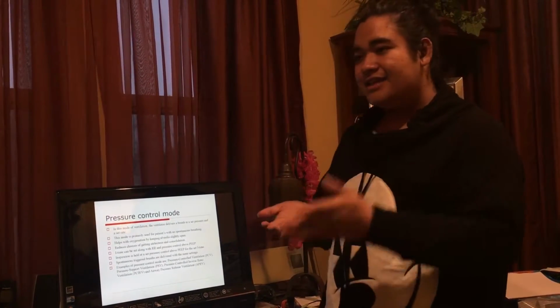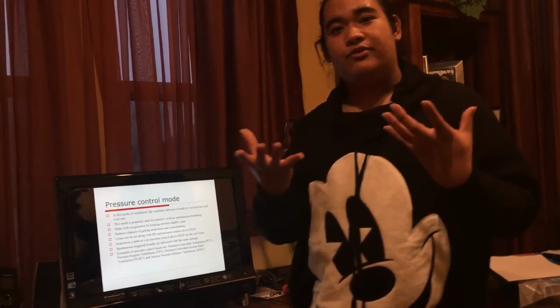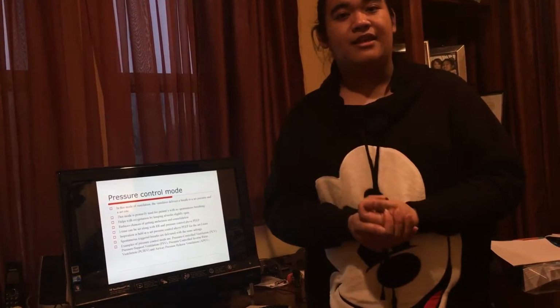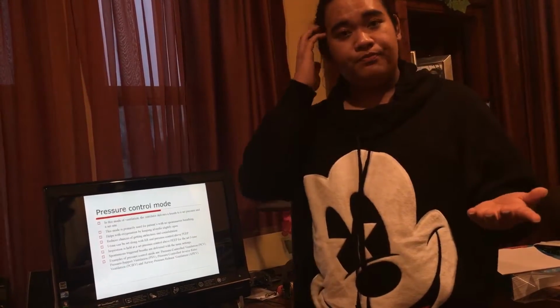On the exhalation, it applies another pressure, which is called PEEP, or positive end expiratory pressure. So let's say we put the PEEP at 4 or 5.